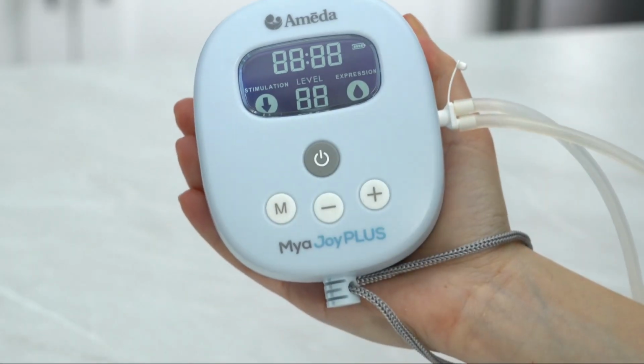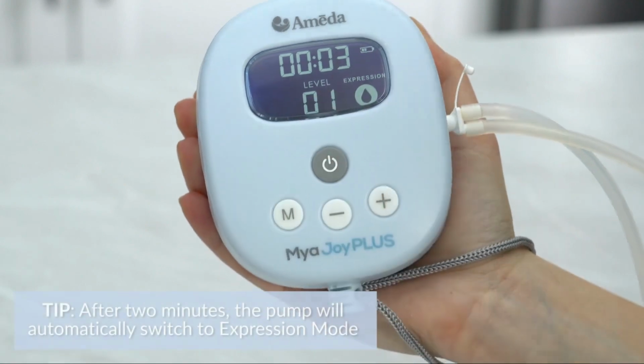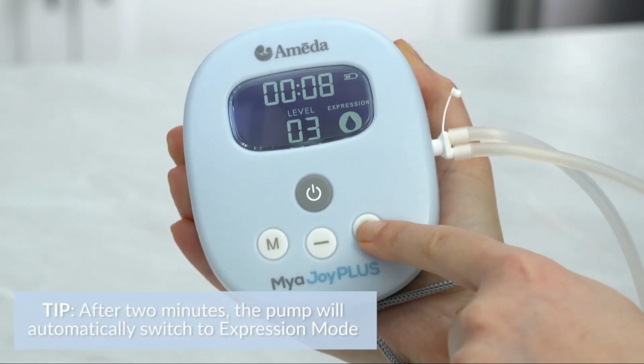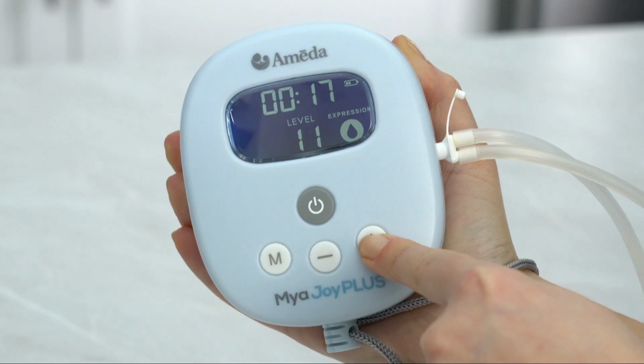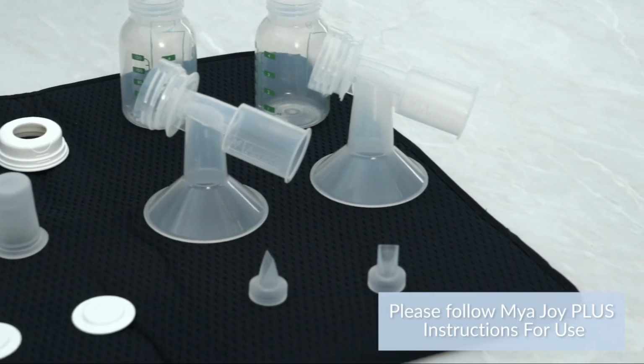Once your milk starts to flow, press the mode button to switch into expression mode. You can adjust the expression vacuum level between 1 and 12 to your preferred comfort level. When you wish to stop expressing, press the power button, then remove the milk collection kit from your breast. After every use, clean parts.